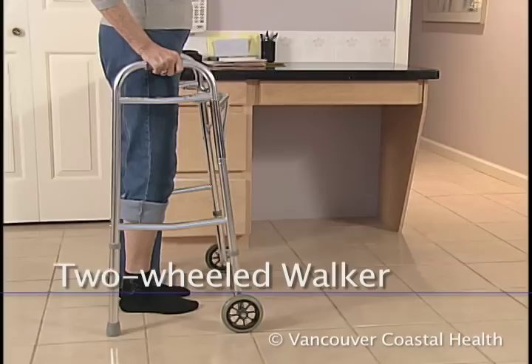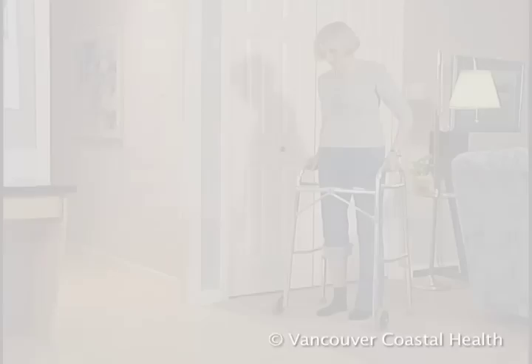After surgery, some people first use a two-wheeled walker. This walker allows you to move faster and it slides easier on carpet.